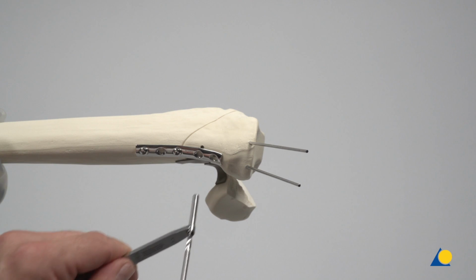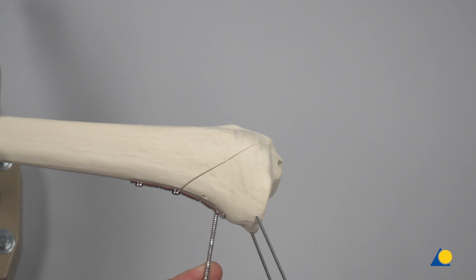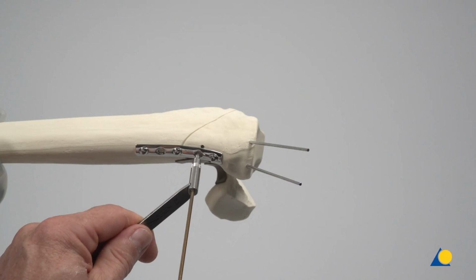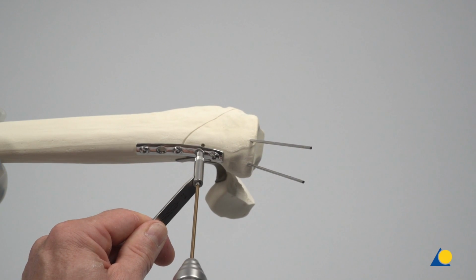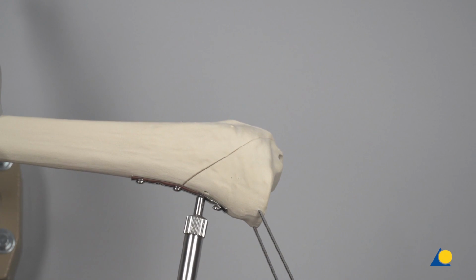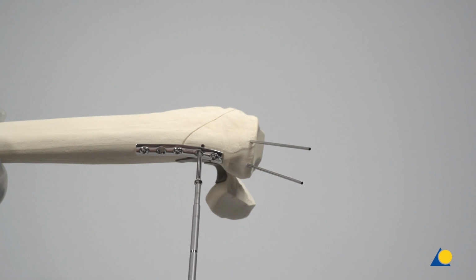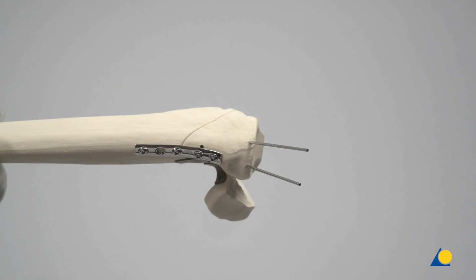Additionally, in order to achieve interfragmentary compression, the cortex under the plate must be over-drilled with a 3.5 mm drill bit. To prevent interference between the screws of the medial and lateral plates, the screw lengths and their trajectories are planned. After each screw insertion, they are verified under image intensification in both the AP and lateral planes. Note, the second screw has also been over-drilled.